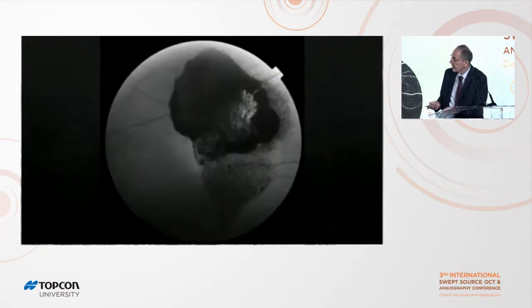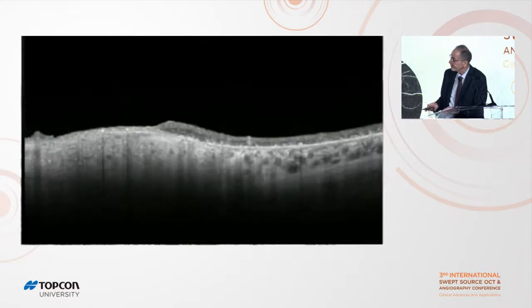apart. And this is the autofluorescence imaging after treatment. Basically, you see a hypoautofluorescent inactive lesion. Again, some changes from prior subretinal fluid. And this is the swept source OCT showing atrophic inner retinal layers from transpupillary thermotherapy application. And there's increased transmission of light because of RPE atrophy induced by the treatment.